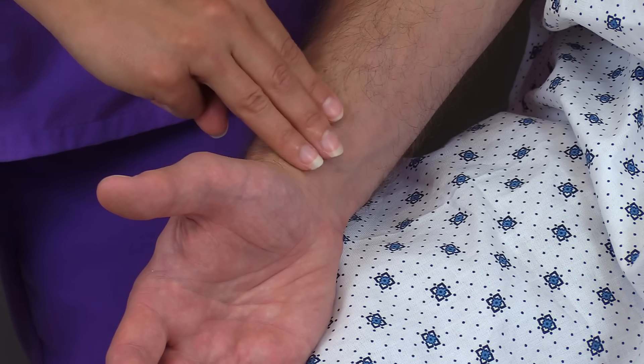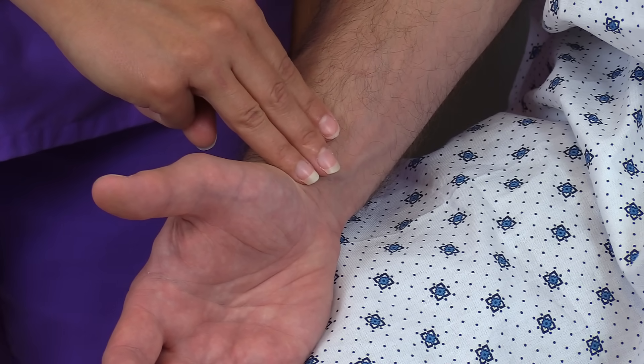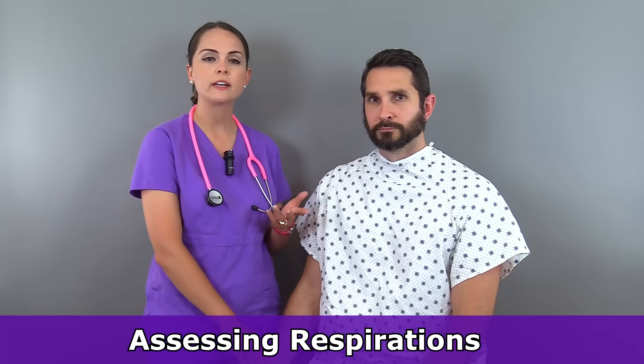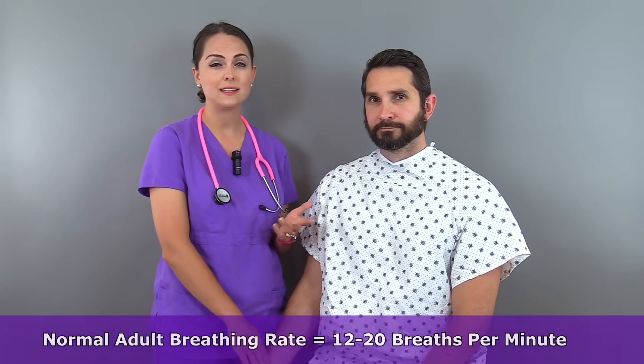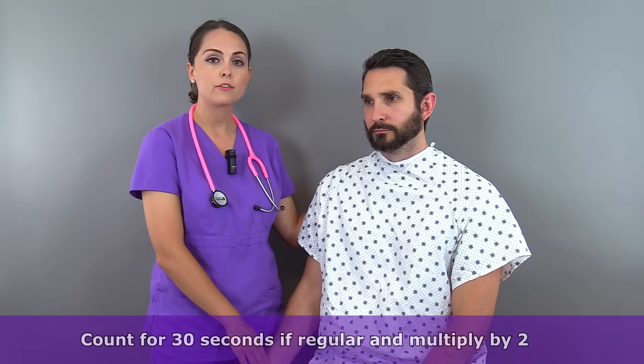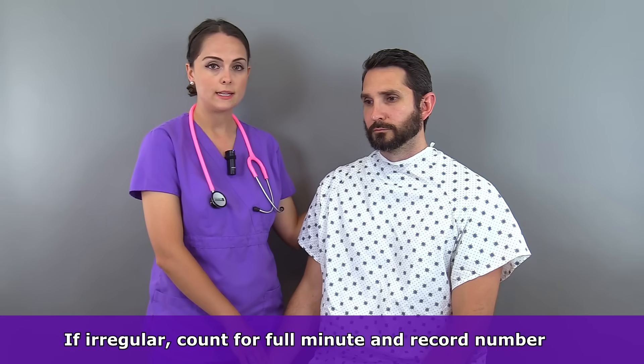Keep your fingers in place, because next we want to check the patient's respirations. If you tell a patient you're checking their respirations, they'll alter the way they're breathing. When assessing respirations, we look at the rate — normal is 12 to 20 breaths per minute — the depth, whether it's labored or unlabored, and the rhythm. The easiest way is to watch the patient from the side and observe their gown rising and falling, since one rise and one fall equals one respiration. You can also gently place your hand on their back to feel the rise and fall. Count for 30 seconds if regular and multiply by two; count a full minute if irregular.